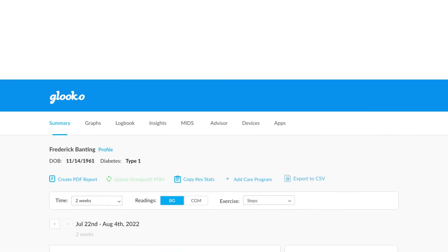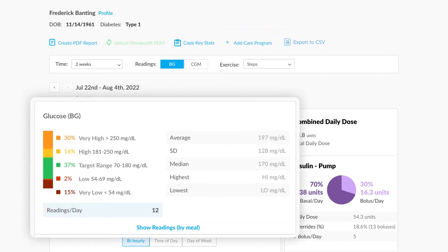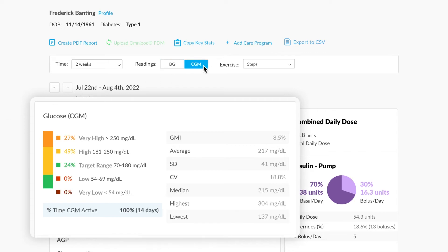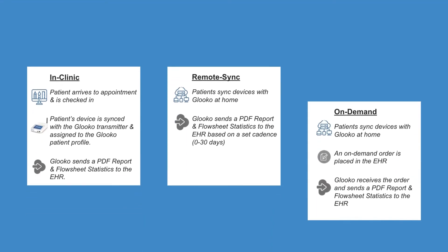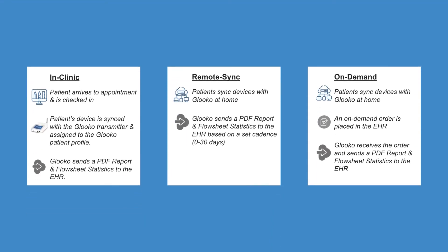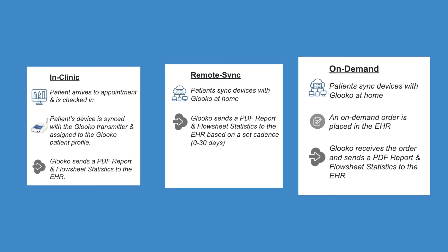Glucose captures key statistical data that can be easily synced with your EHR via our flowsheet statistics integration. Current average calculations may be captured and integrated into your EHR. Similar to PDF reports, there are three ways to sync the flowsheet statistics from Glucose into the EHR – in-clinic, remote-sync, and on-demand.